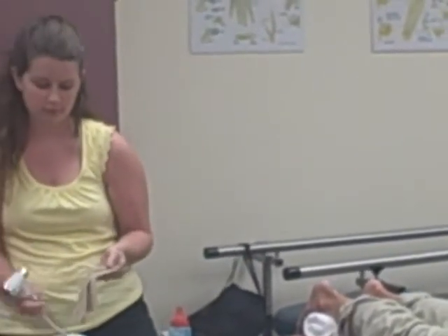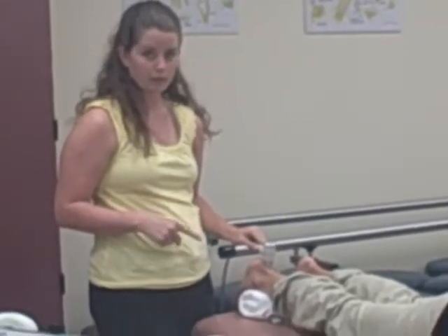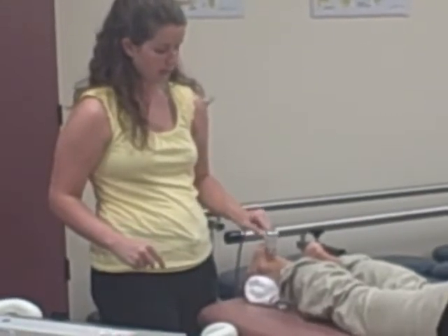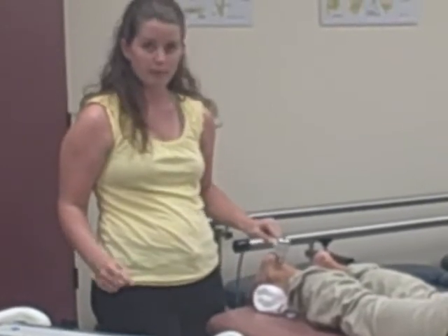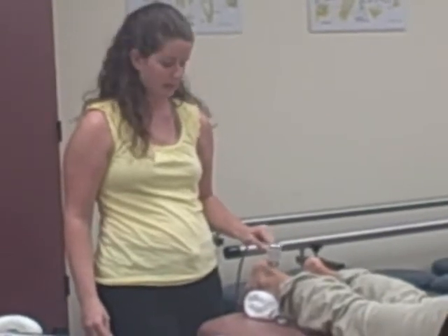Before we put the head on her, we want to make sure that we clean it. So we're just going to give a nice little cleaning there. And then we're going to put the head on her Achilles tendon before we turn the ultrasound on. You can do little circles or a little S shape, but you just want to make sure you maintain contact. And you do this before you turn the machine on. Highly important. So we just move, and we would just do this for 7 minutes or so.